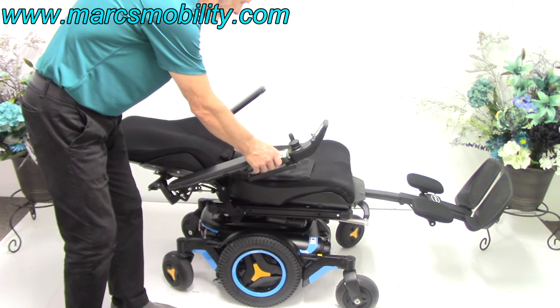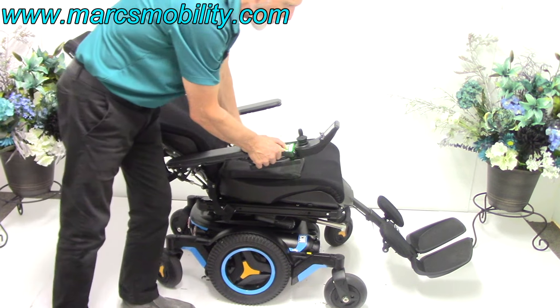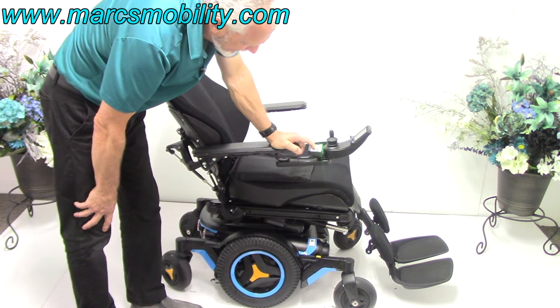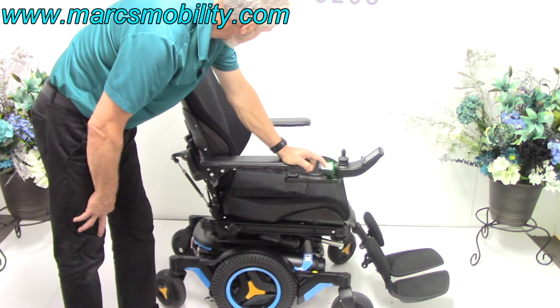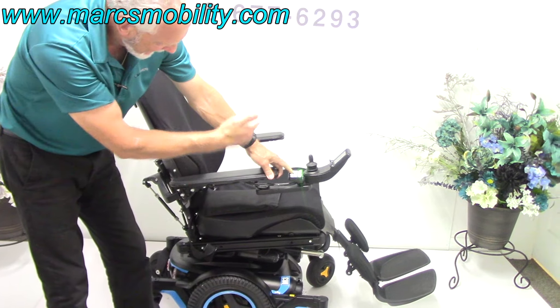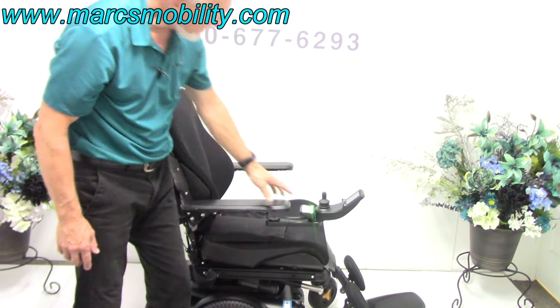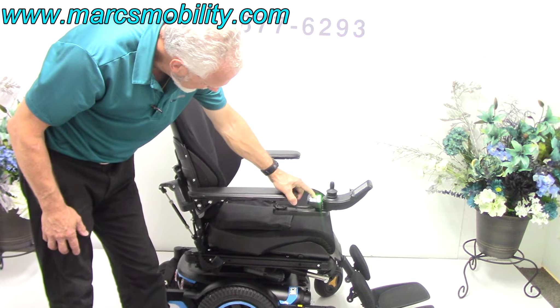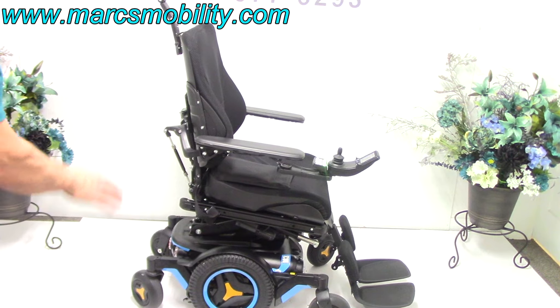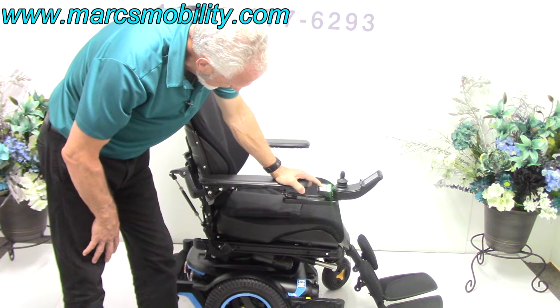I'm going to bring the legs and recline back down. The last feature is called the anterior tilt, which leans you forward. When you're outside, I always leave the legs out roughly that much so you don't hit anything on the sidewalk and damage the electric legs. Now, the electric tilt goes back like this. But if I hit the button forward — now we've got the interior tilt, about a 15-20% tilt down. That's the most you'll get, but it helps you get out of the chair.